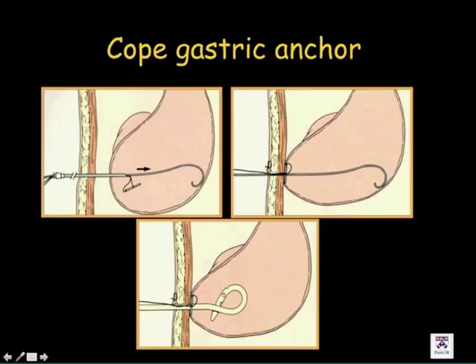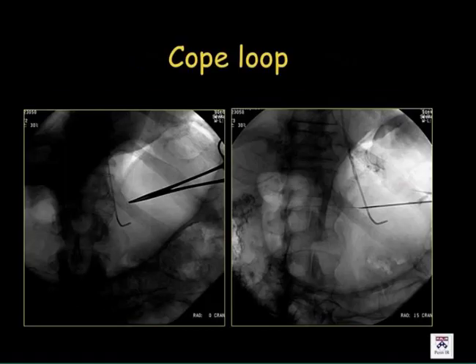You see, there are two strings attached and one to the end, so at the end we're supposed to pull it. For some reason, it never worked. It's not the design that we use now. One more time, I'll talk about anchors a bit later. It's actually a big issue. So that's what you usually do.